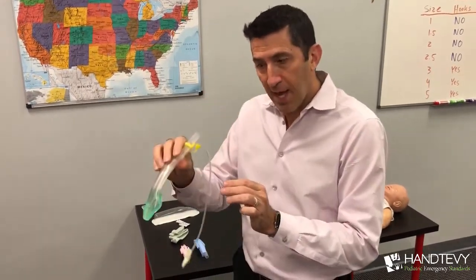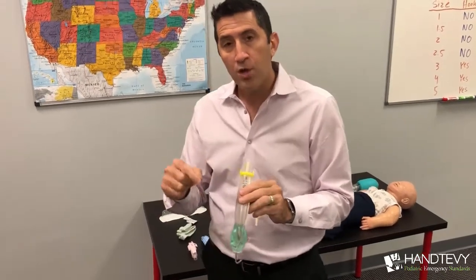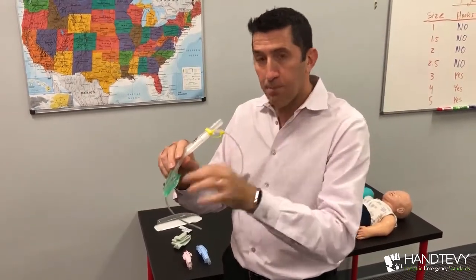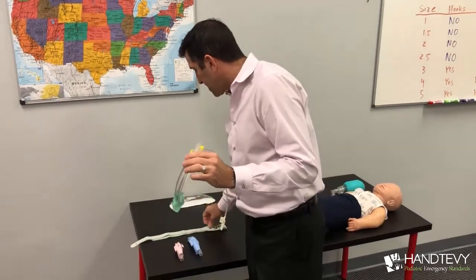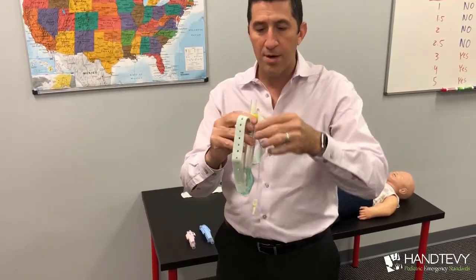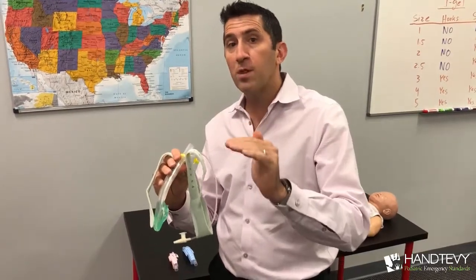After you insert the i-gel, before you strap it down, you can actually get that Salem sump all the way down. When you measure, you measure from the corner of the mouth, around the ear, down to the xiphoid process — that's how you measure the Salem sump. It's important not to strap down the i-gel before you've pushed the Salem sump down to the appropriate distance. Once the Salem sump is loaded and the i-gel is inserted, the next step is to secure it. They've created a strap that goes right on these hooks and then around the patient's head, hooking on the other side — strapping it down behind the patient's head. Very easy to use.